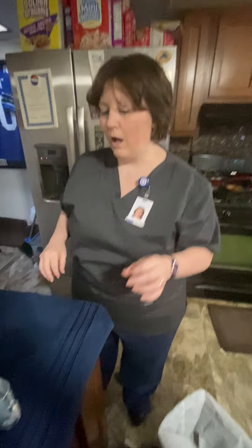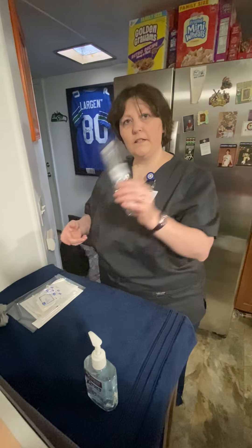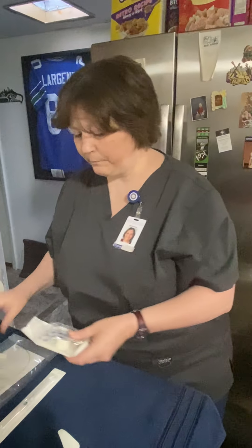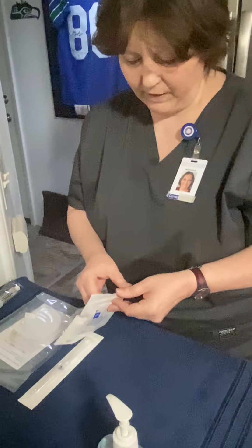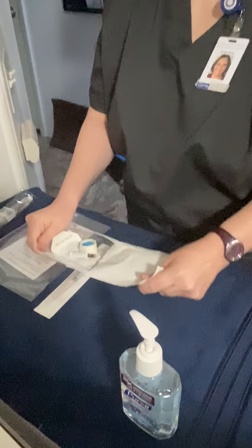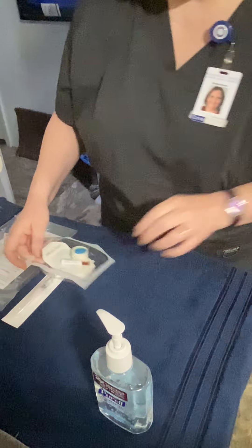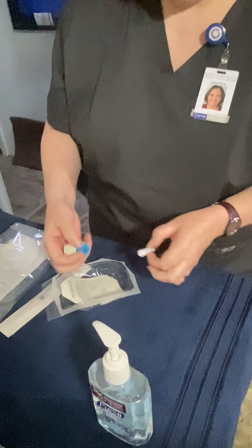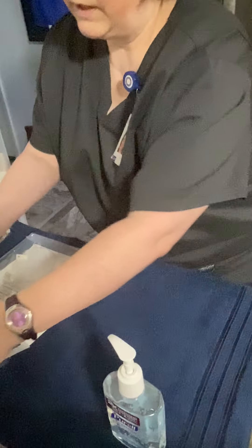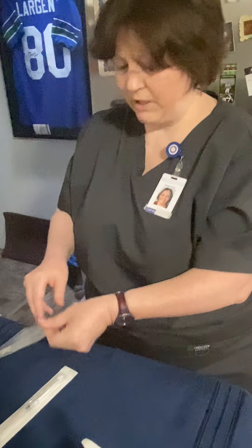All right, so I have my supplies here, so I'm going to go ahead and get them ready. I have my saline for my flush, my IV, my kit, and my tubing. The first thing I'm going to do is open my kit — it has my bandage, my iodine, my tape, the alcohol wipes, and the tourniquet. Then I'm going to open my tubing next.